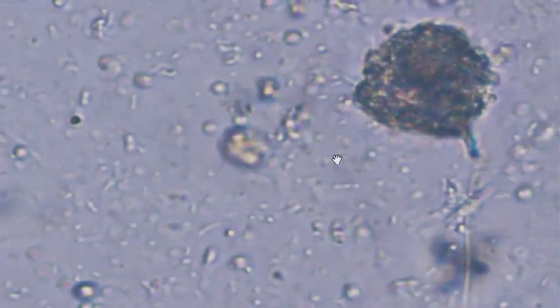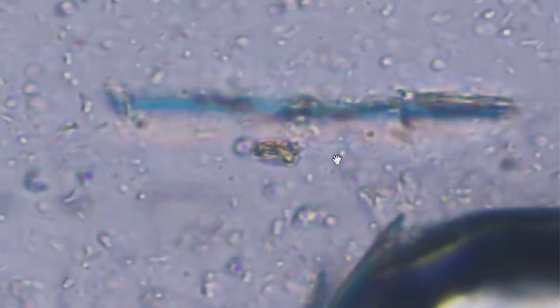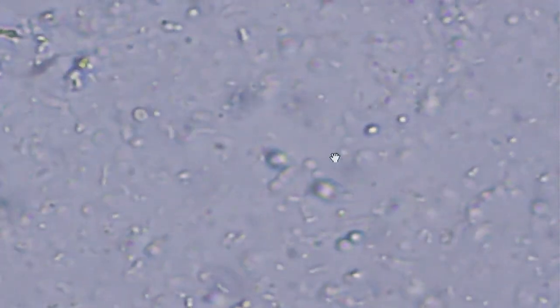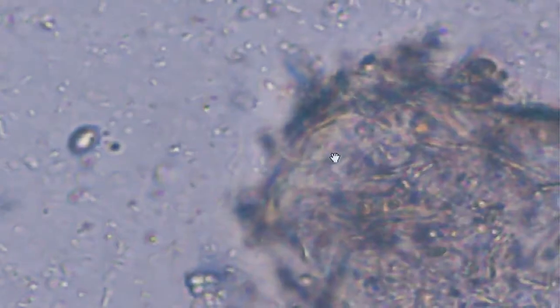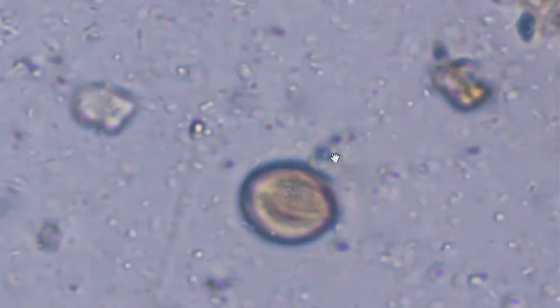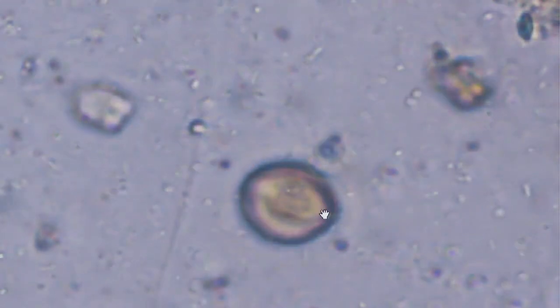And this is looking nice. So we've seen 2 nice Entamoeba coli. Of course, you have to scan through the entire slide and look for other species of protozoa that may be present. Now I've seen 1 protozoa as a commensal. I'm interested to see what else they may have, because they might have other things. Particularly, this shows they've been exposed to fecally contaminated food and water.